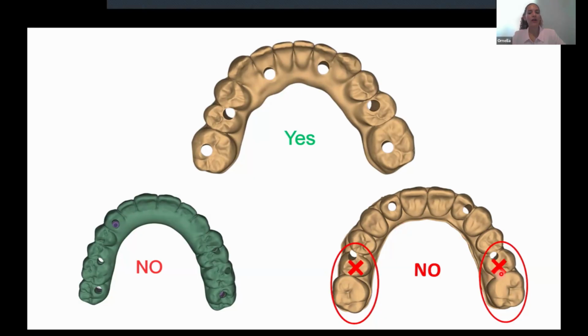The all-on-4 has some issues, okay? It is cheaper because we place fewer implants, but in these types of cases, we need to review the design correctly. Why? Because we can have big pontics, sometimes more than 2 pontics, or we can have big cantilevers, okay? With the graphene, we can place 1 cantilever, okay? But not 2 cantilevers, as we can see in the image.